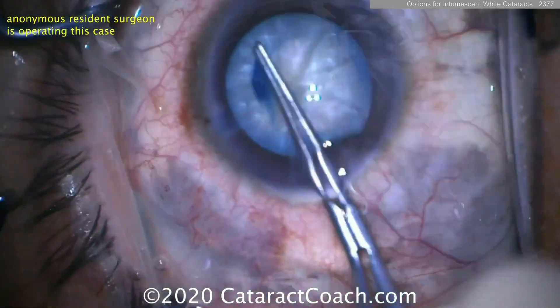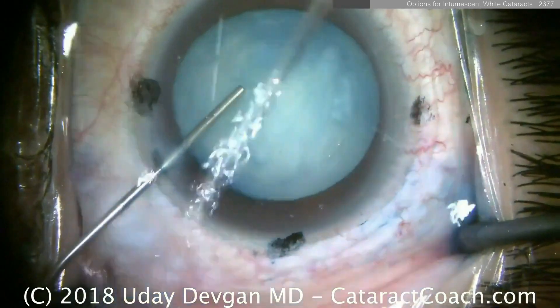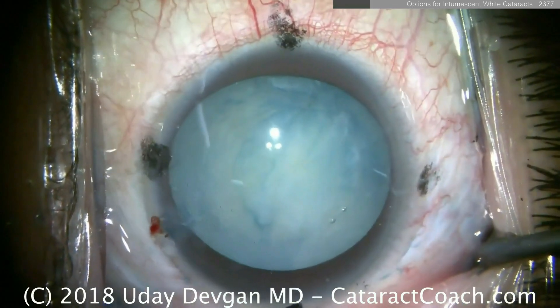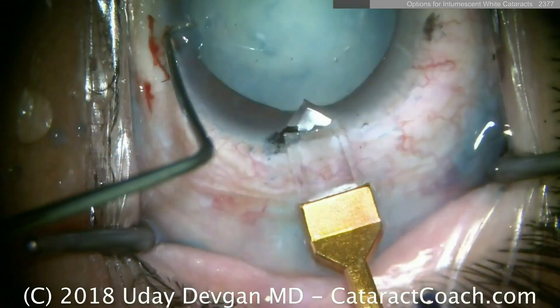You don't have that posterior pressure that's going to cause the risk for the capsule to run out. Now here's another one with femtosecond lasers. Lasers are great too, but if you look at the femtosecond laser it wasn't a complete rhexis — the reason is it takes a little time to make the capsulotomy.